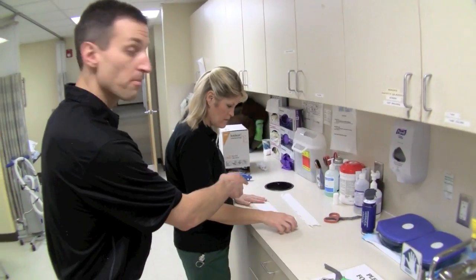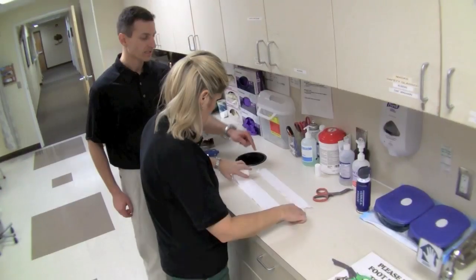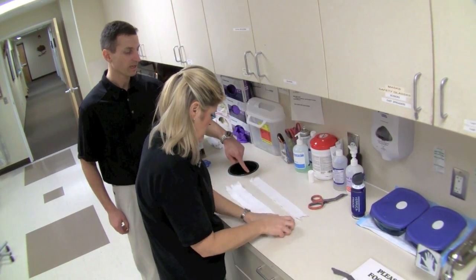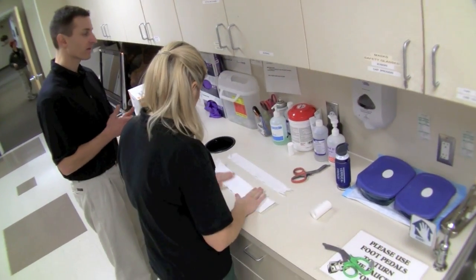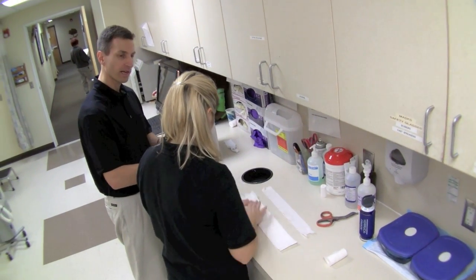This is going to be our padding, just to make it a little bit more comfortable — this is webryl, made to the same length as our splint is going to be. That's three and four layers of webryl. And the fiberglass padding, that's a little thicker. Would you put four layers of that as well? Yep.